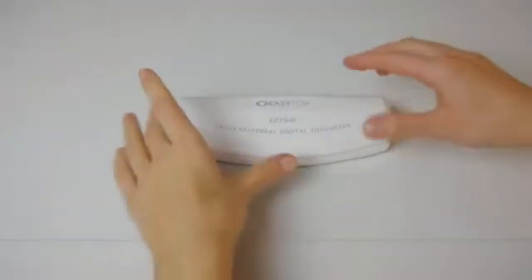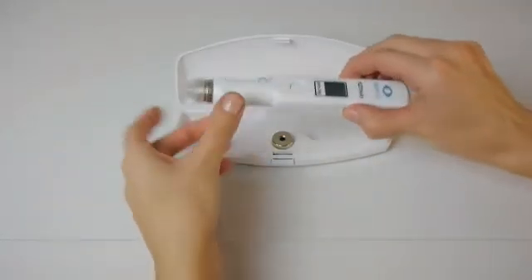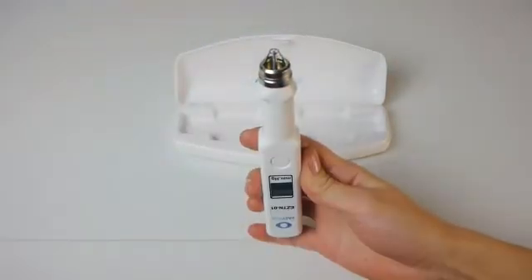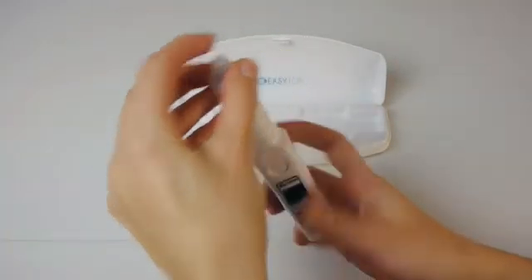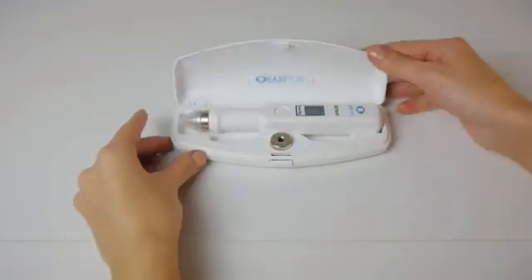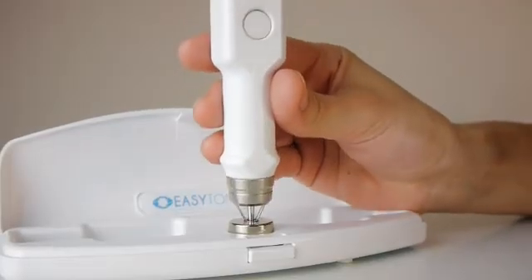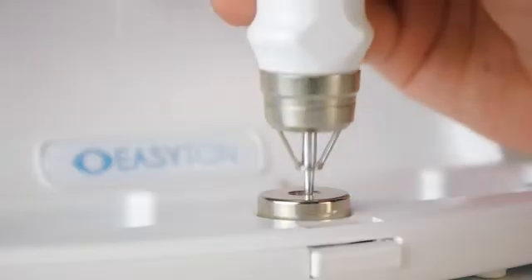Maintenance. Do a routine inspection daily and check the tonometer functionality before each measurement of intraocular pressure. Check the tonometer functionality at least once a week using the tester. Also, checkups are needed after long work breaks, after dropping the device, and in any other cases when you doubt if it is still operational.